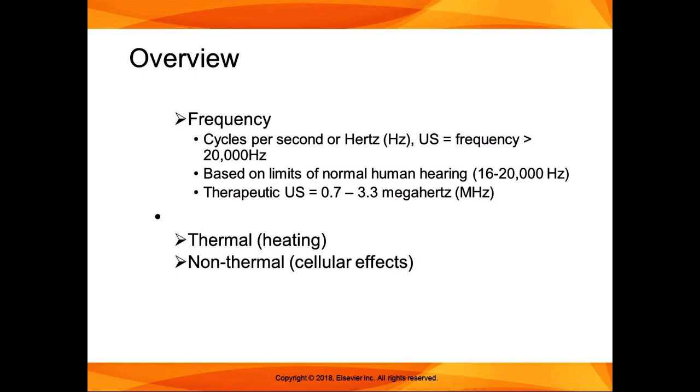As the ultrasound wave travels through material, it attenuates. Just like audible sound, as you get farther away from it, it attenuates, it gets smaller or lower, and you can't hear it as well. The same thing happens with ultrasound. And so as ultrasound moves through human tissues, it decreases in intensity as part of it is absorbed by the tissue.